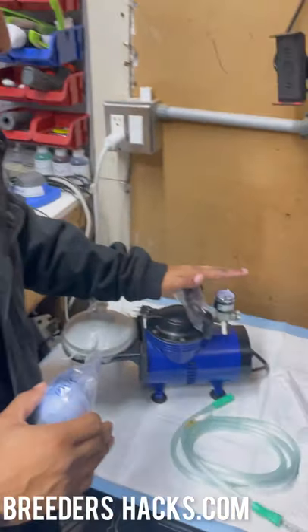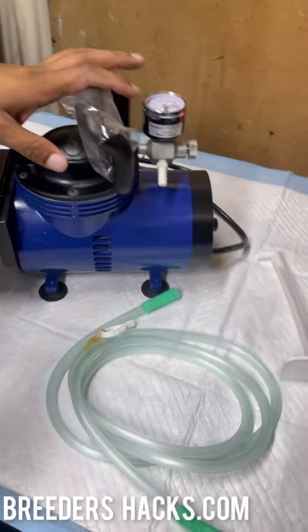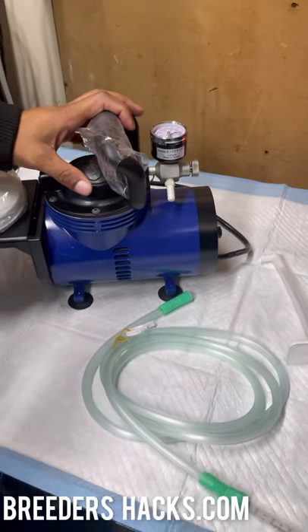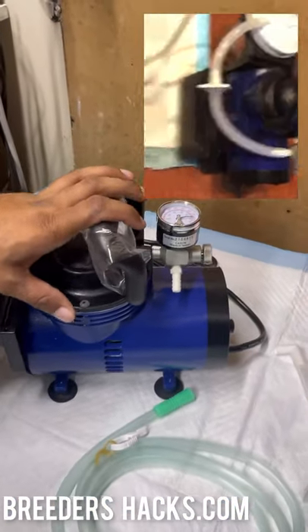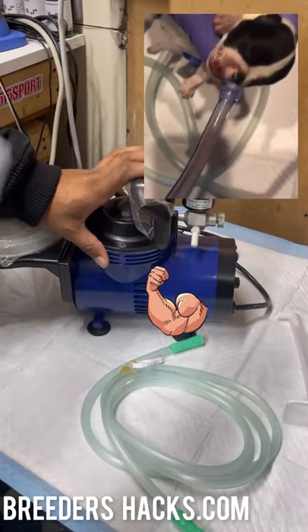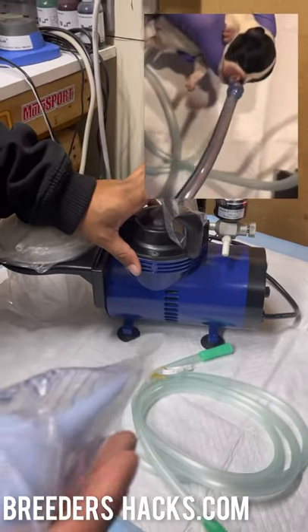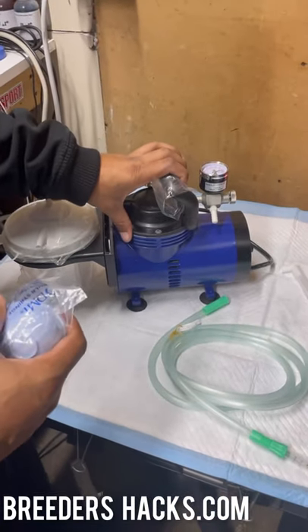This machine right here is super heavy duty — it's actually designed for humans. It's a suction machine with a built-in compressor. The pressure it generates eliminates mucus from the puppy's nose and rips it right out. It's very difficult to harm a puppy with something like this.